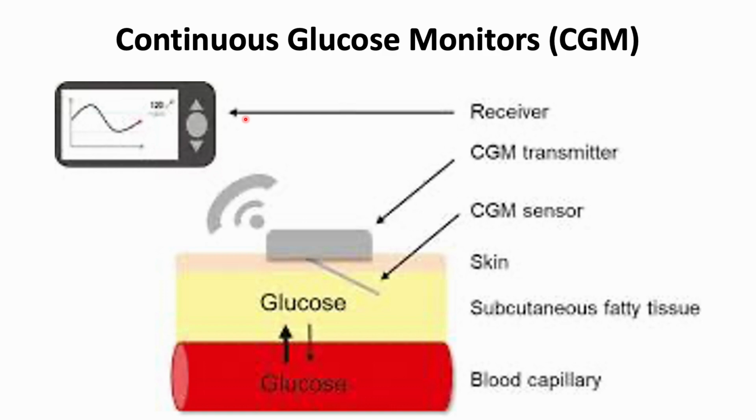This can allow patients to have alarms set for if they're dropping or if they're already hypoglycemic or hyperglycemic, and it allows them to really see what's happening when they are eating, when they're exercising. We know in many studies, CGM alone helps patients control their blood sugars better. And certainly for patients who are on insulin therapy, this has been an absolute revelation and has changed the way that we are able to manage diabetes for patients and adjust their therapy.